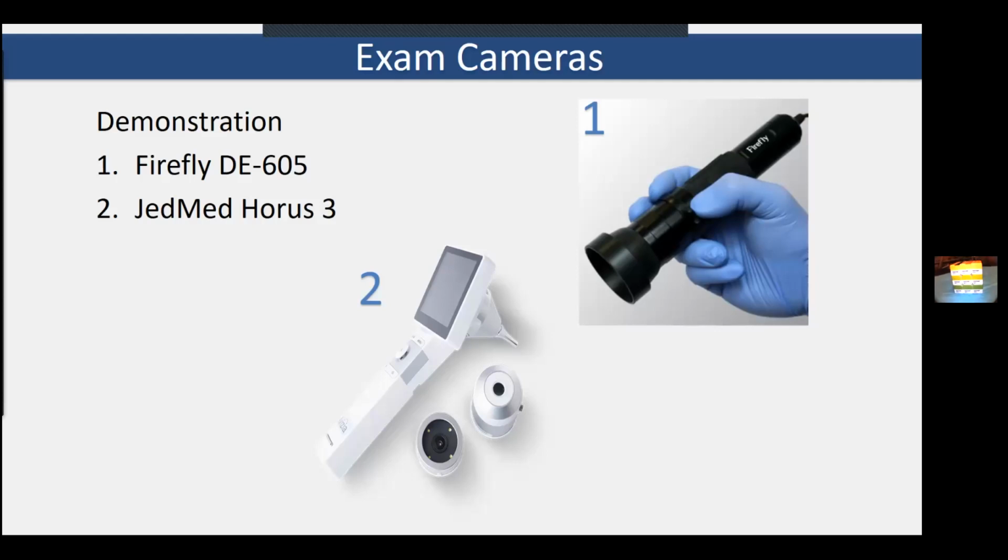And then we're going to show you some skin detail from the device. So I'm going to take the device here. We're going to dial in the focus. And it has a nice little hood on it that gives you a really nice distance for most dermatology imaging. So what I'm going to do here is twist it to apply, and this is actually removing the polarization filter. You can see the shine and the depth of the image is applied, and then I can rotate it back. And this produces a really nice color image, gives us information about the detail of the structure, but removes that shine.